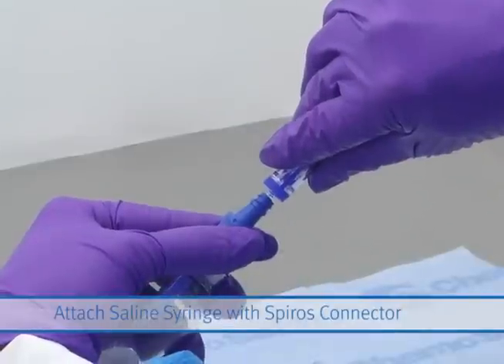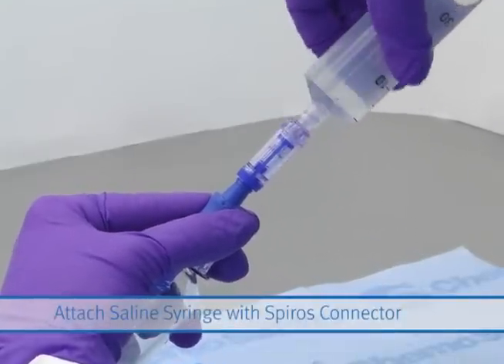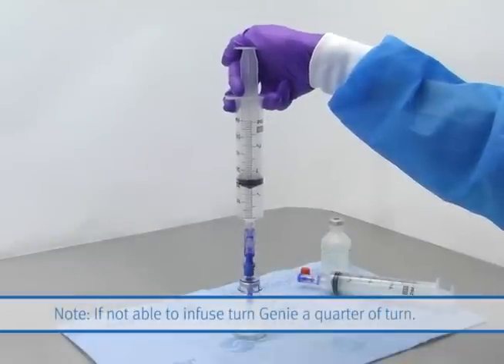Attach the Spiros onto the syringe and pull up the required amount of diluents to reconstitute. Infuse the diluents into the drug vial.